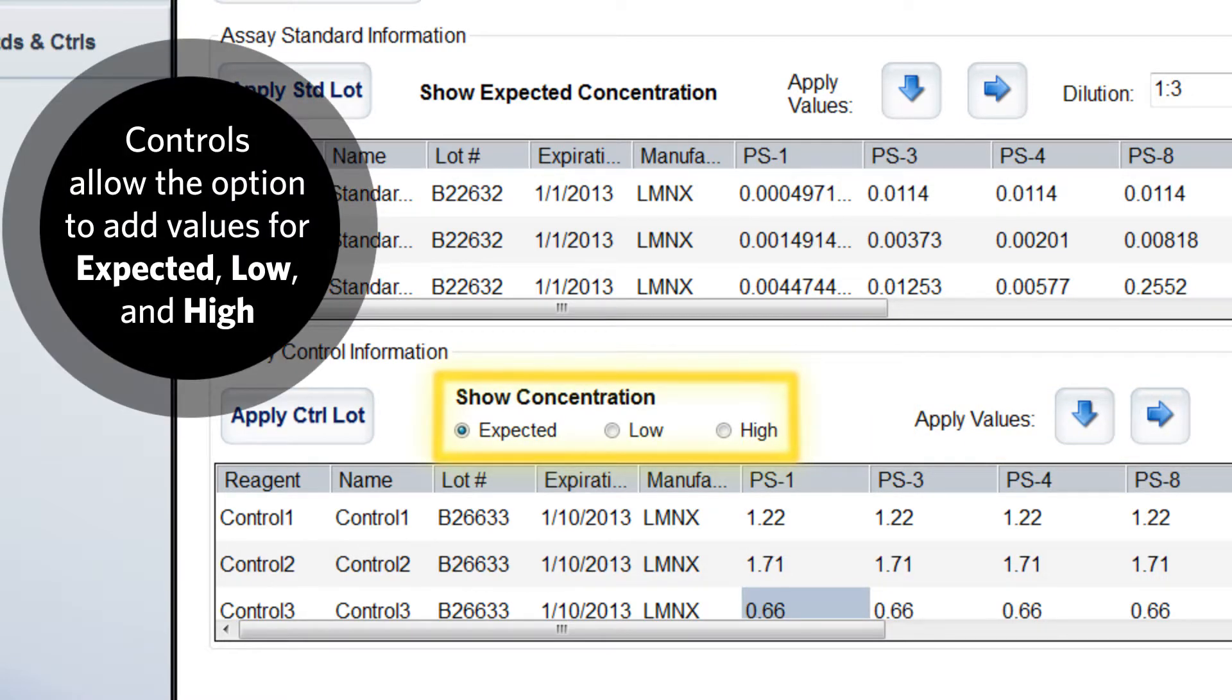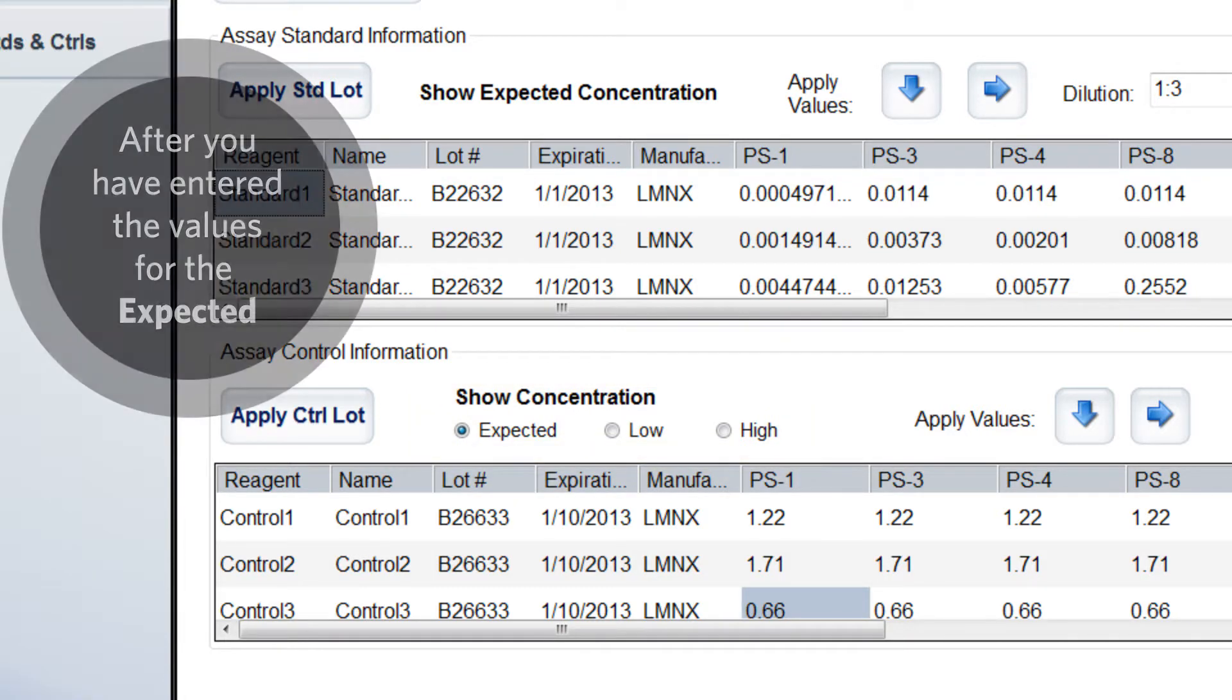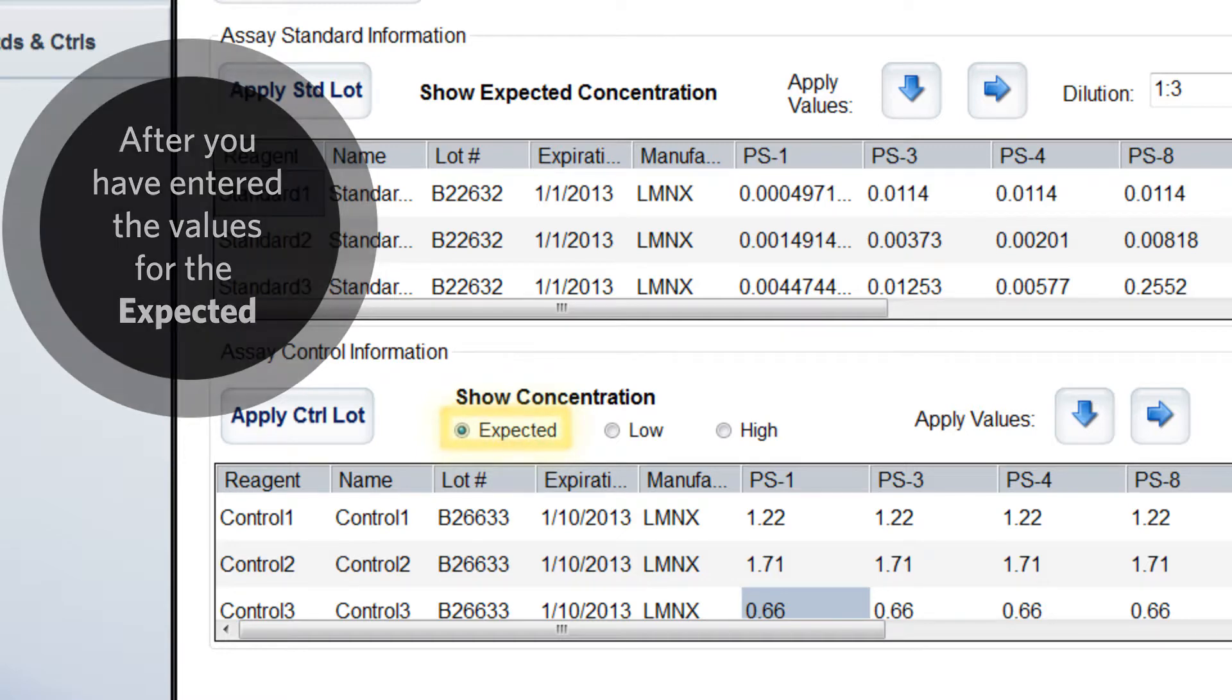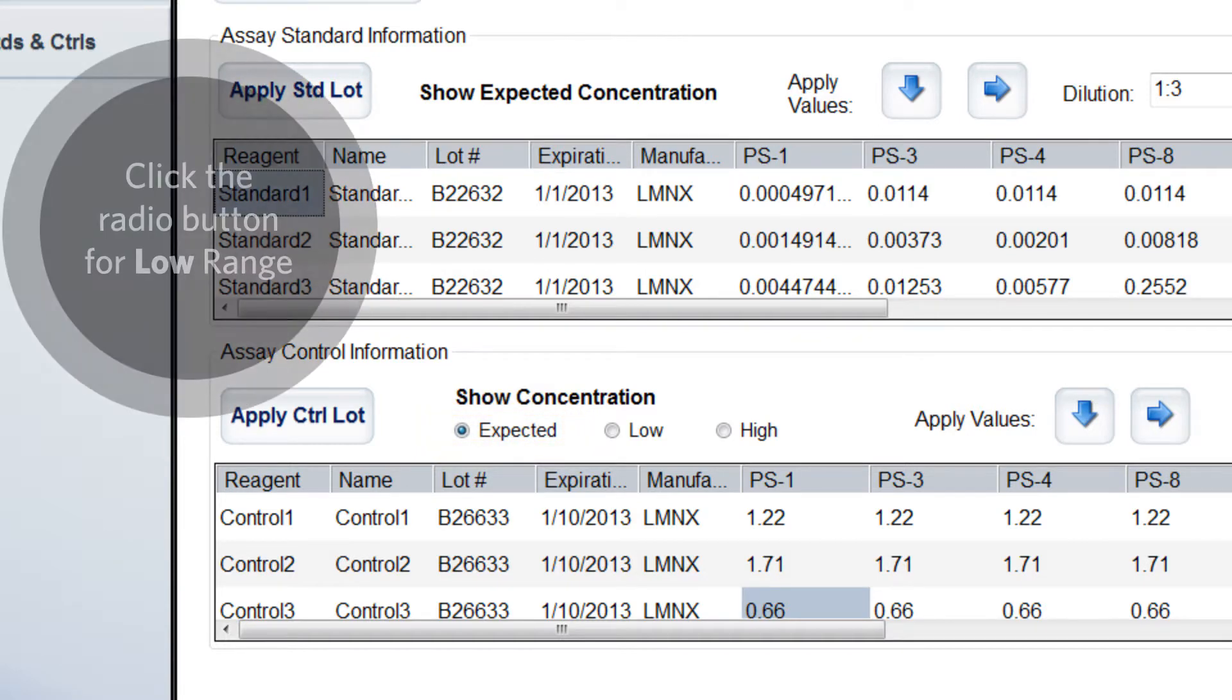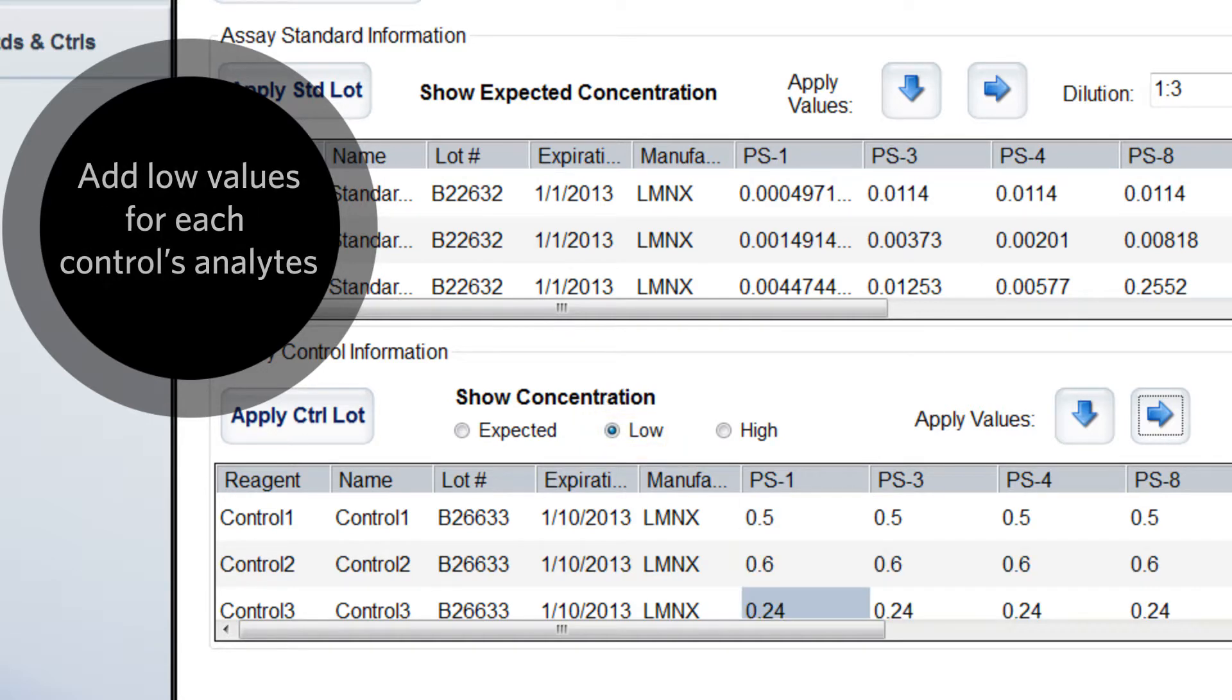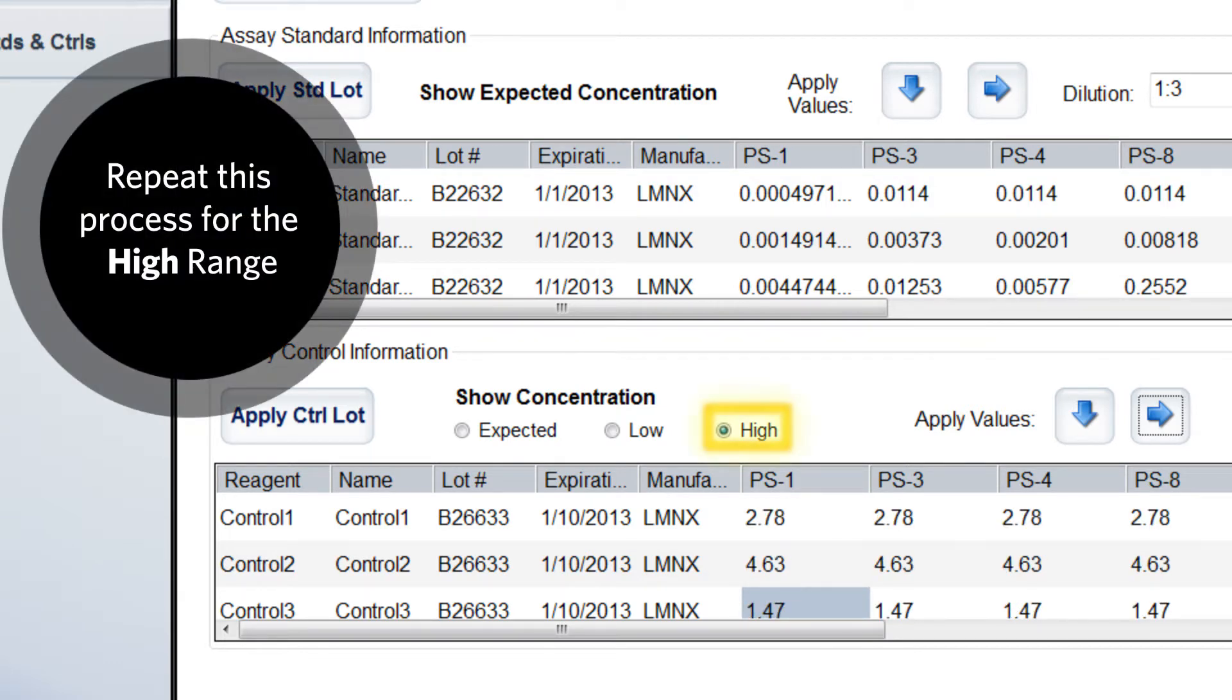Enter values for expected, low, and high. For example, after you have entered the values for the expected range, click the radio button for low range and add the low values for each control's analytes. Repeat this process for the high range.